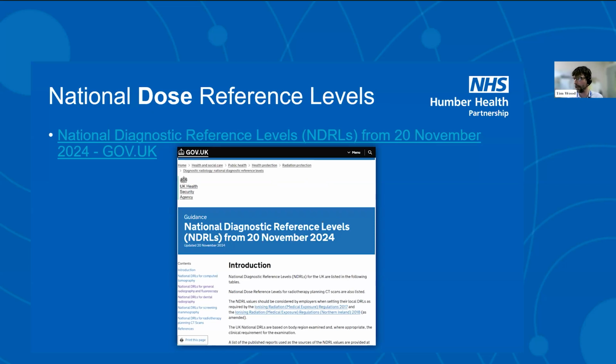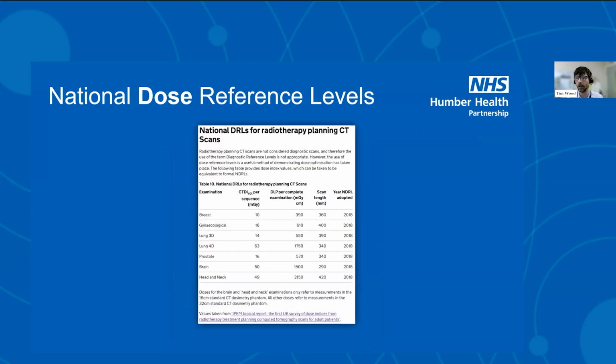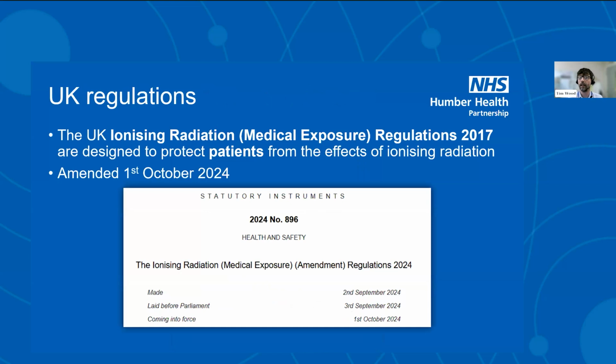Okay. Now, in the early days, there was a lot of debate because traditionally we talk about diagnostic reference levels. And so there was this specific thing changed where on the UK website, these things are identified as dose reference levels. People often get upset about the term diagnostic. Okay? So these are published. These had some weight, but they weren't necessarily legally enforceable at that stage.